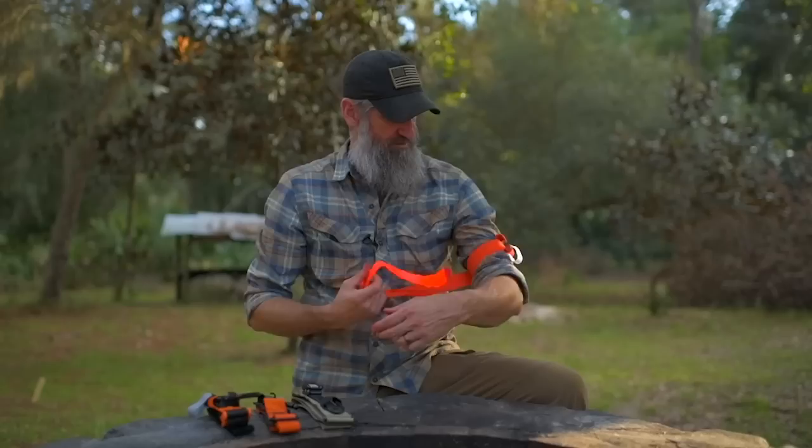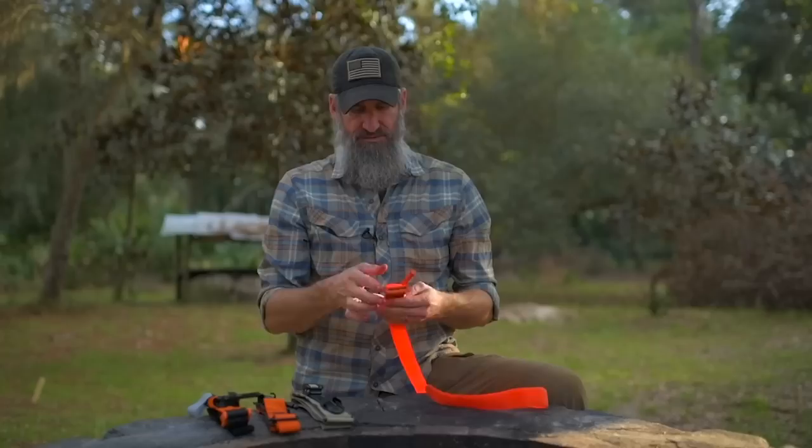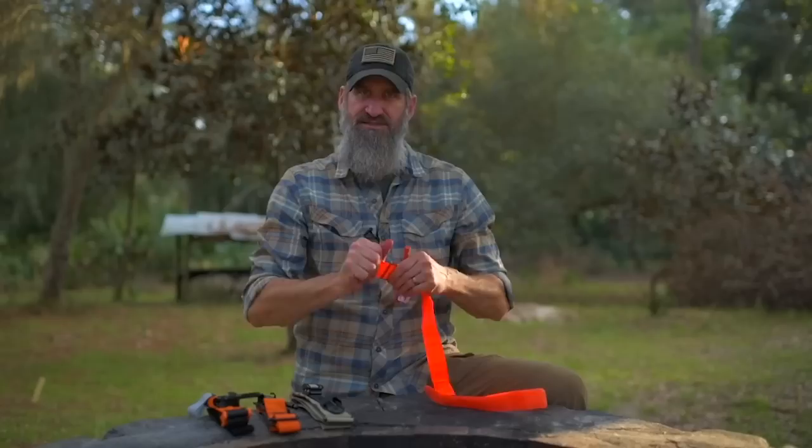What you don't want is for your adrenaline to be pumping with your fight-or-flight response going and then find that your tourniquet wasn't properly configured before you started. Take a little bit of time, set these up before you place them in your kit, and you won't have to worry about it. Make sure you practice with these.